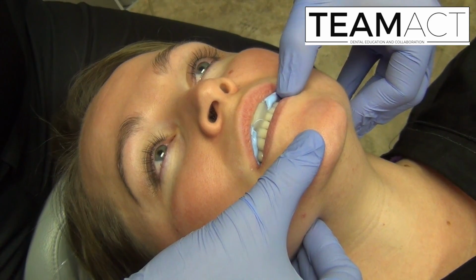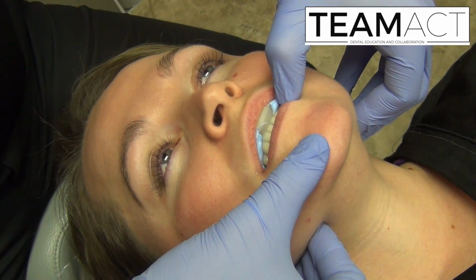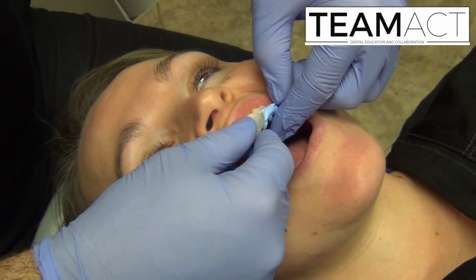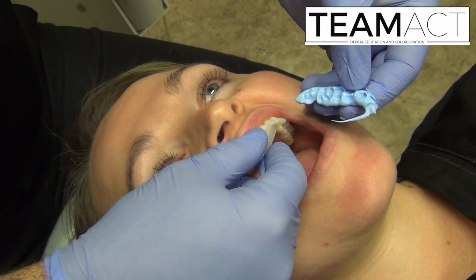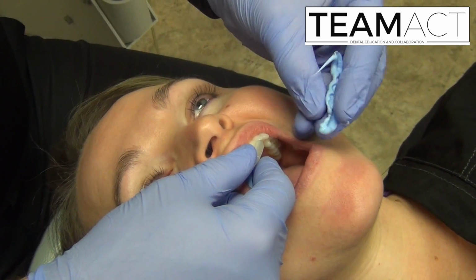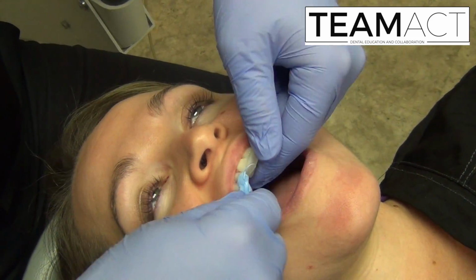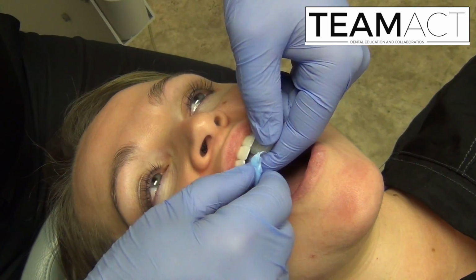Once it is fully cured, see me there testing it to verify that it has cured. I will then remove the material, evaluate it to ensure that I've recorded both the maxillary and mandibular occlusal surfaces. Once I've confirmed that, I will proceed to trim the record.